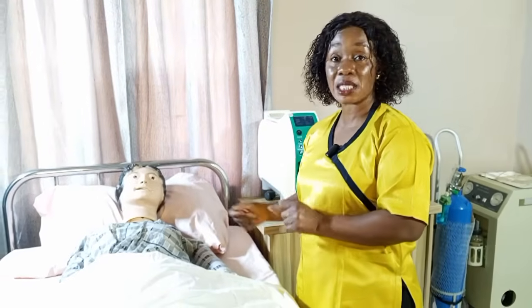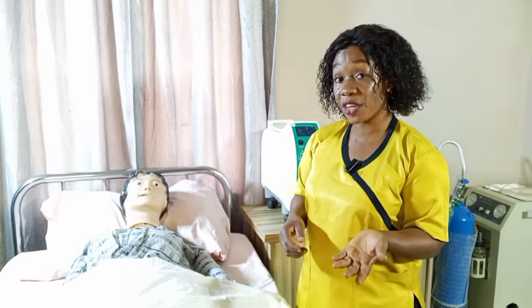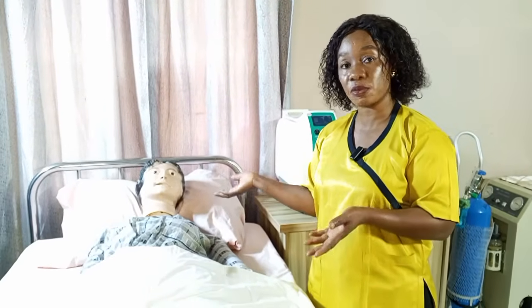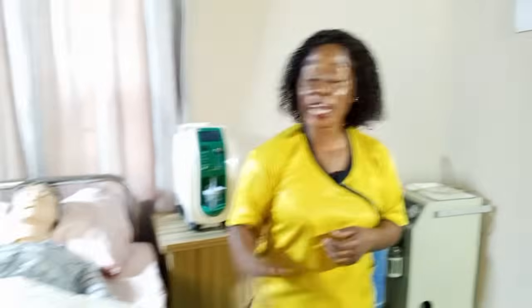After identifying the patient, I have to place this patient in a cardiac position. Remember, this patient is suffering from asthma. If it is asthma or congestive cardiac failure, the patient needs to be in a cardiac position. I have to elevate the head end of the bed to 45 to 60 degrees, or 90 degrees, depending on the prescription.